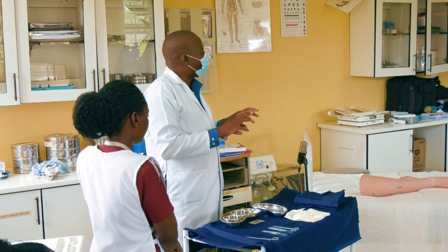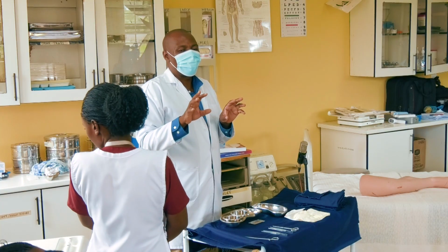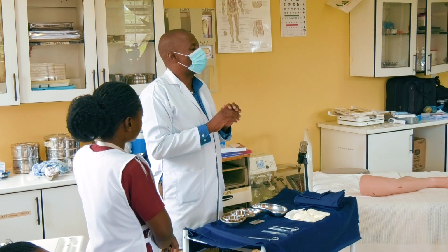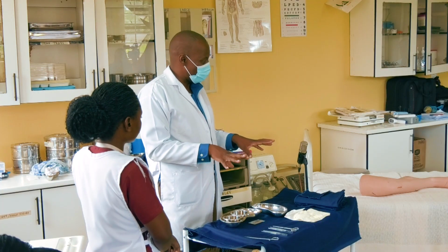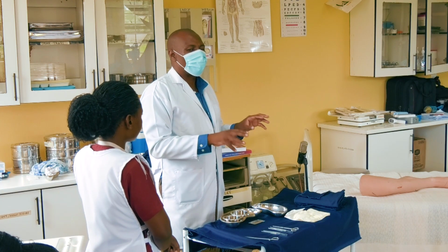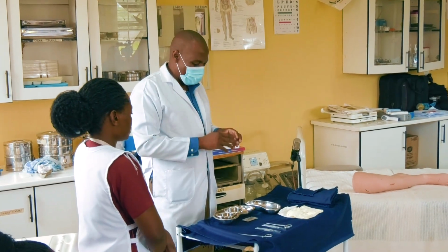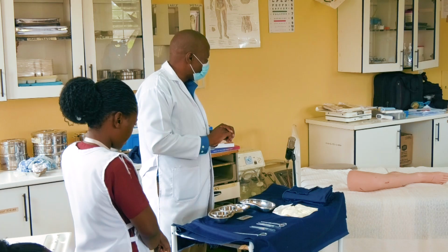You don't touch anyhow. But you find students in here, regardless of how much adrenaline has been produced, please do not touch this area unless you are gloved. Right? There are people that would come here, you are watching them performing, they will be touching these things freely.